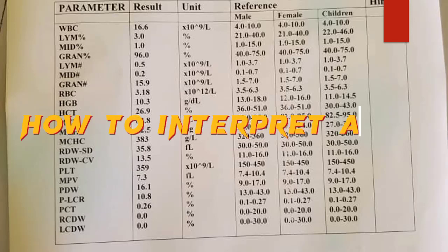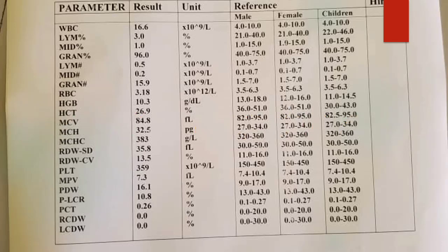Hello there. Today we are going to discuss the white blood cell parameter on the CBC.